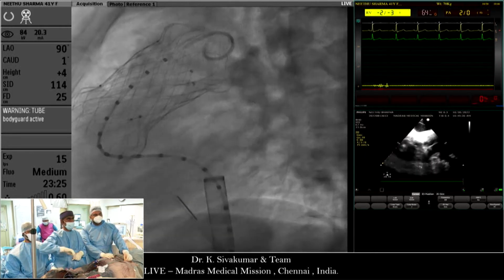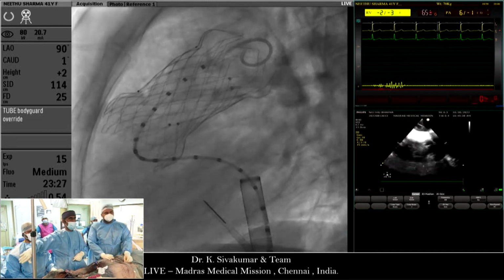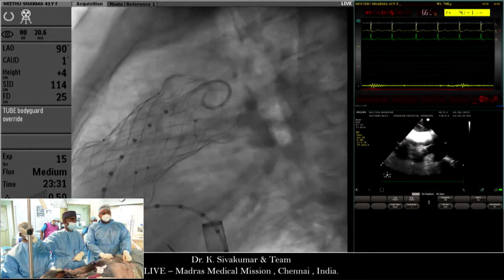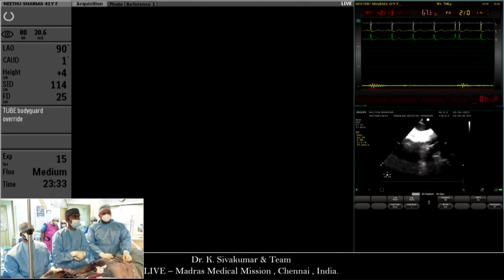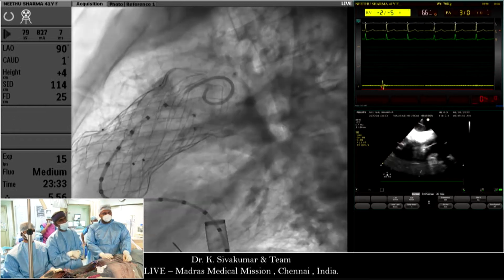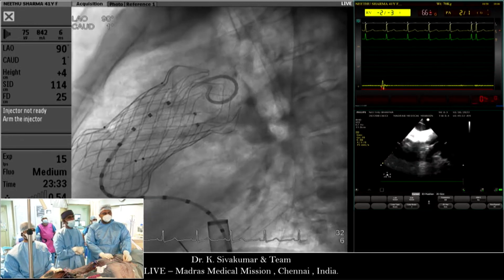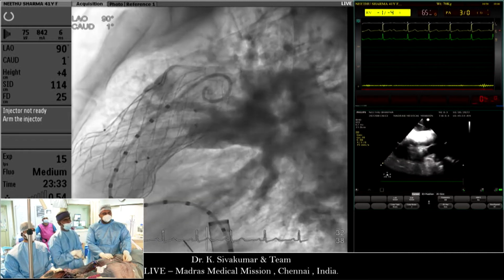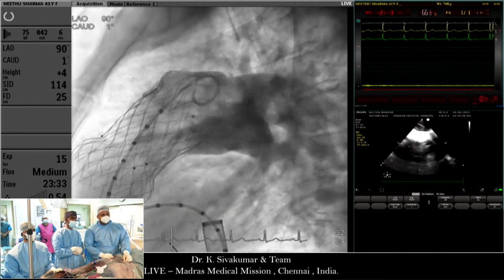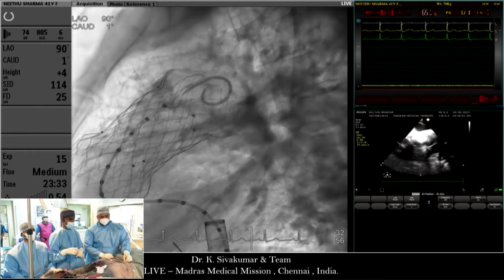Ready for angio? In retrospect, this is probably a little bit longer, but I think that works. Ready? You see, that shows you the RPA end on almost, or not quite really, but it shows the distal flare nicely positioned.